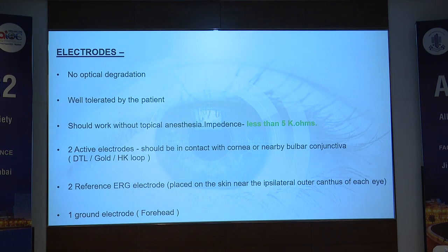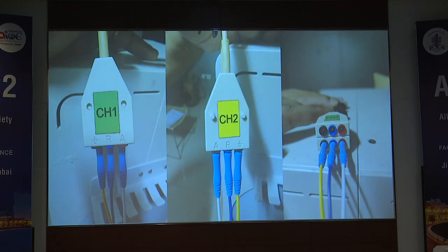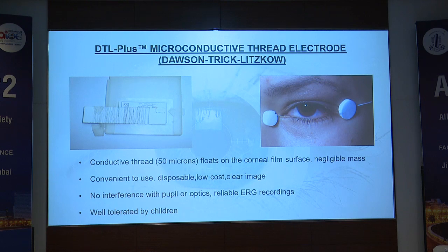The electrodes are the usual ones that have been discussed before. The DTL electrodes are the ones that we use in our practice, and the reference electrodes and the ground electrodes. These are the channels discussed before. I'm not going to go through it again.